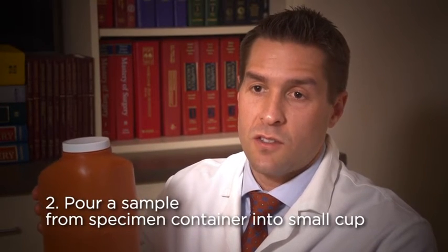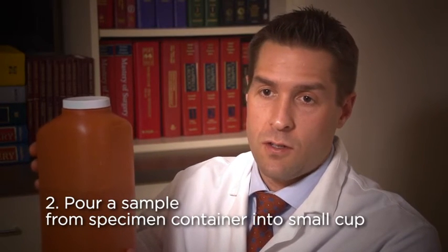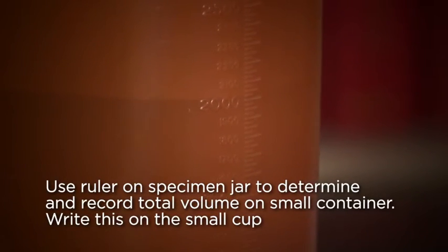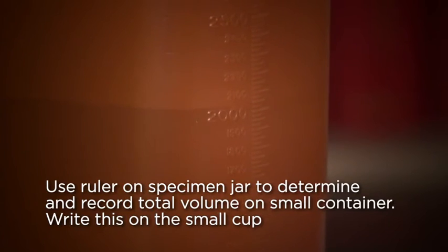The second way to submit the specimen is to take a smaller sample of the larger collection container once the full 24-hour collection is complete. If you do this, we would like you to first mark the volume of the full collection by using the ruler on the side of the collection container.